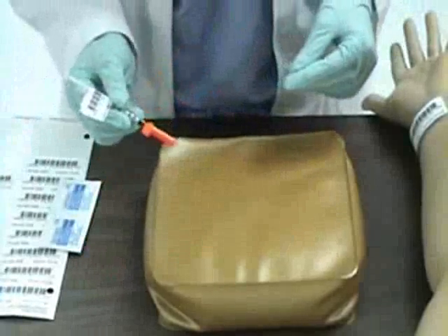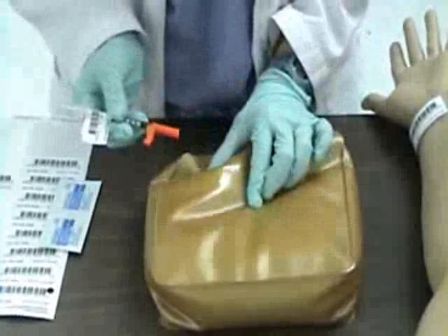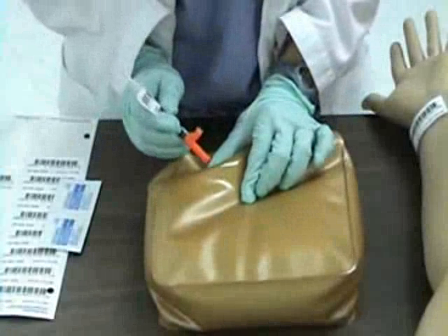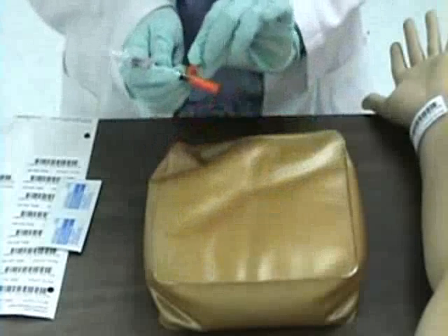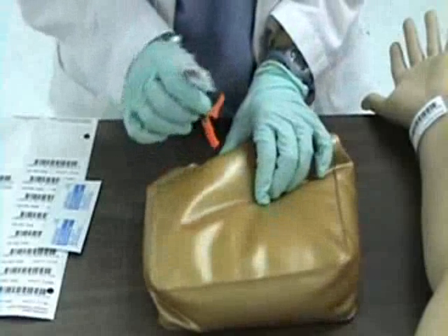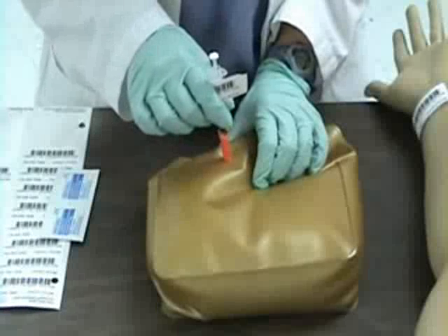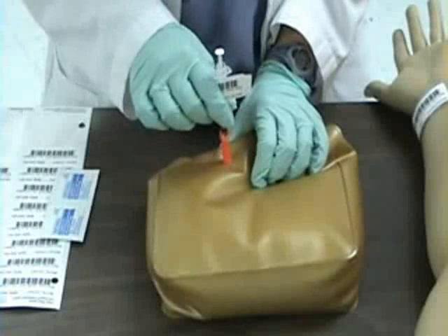There are 2 different ways to give a subcutaneous injection. If you are able to pinch 1 inch of tissue, the angle of injection will be 45 degrees. If you are able to pinch 2 inches of tissue, the angle of injection will be 90 degrees. This is the preferred angle of injection as it will decrease the likelihood of a needle stick injury.